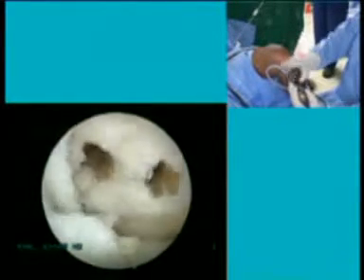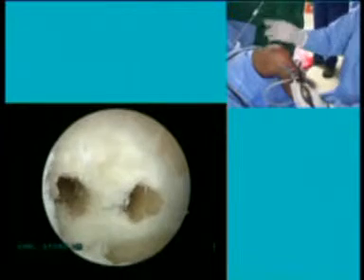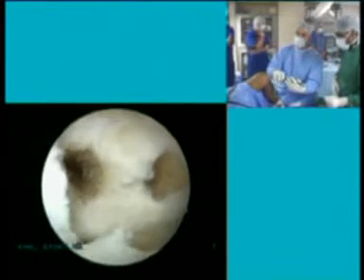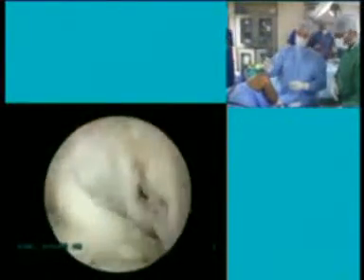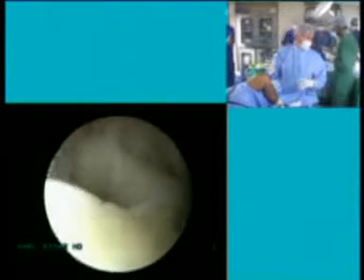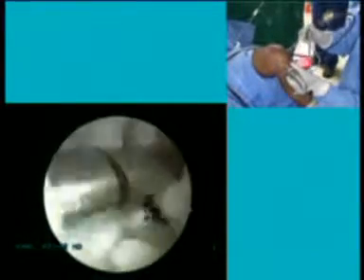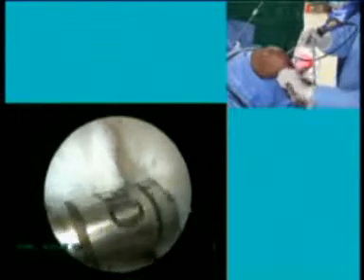Now I will show you a trick. If you have two big tunnels, in this case it is not the case because the bridge is quite big. But if you have a very narrow bridge and you want to prevent the bridge from breaking, then you should use dilators to dilate the tunnels, because you can achieve a much more careful tunnel preparation. You can see here a 6 millimeter dilator, because this instrument does not make as much damage as a drill. That's a very important tip.